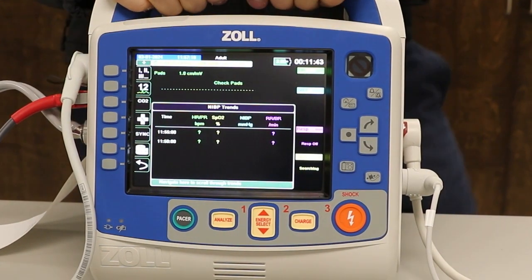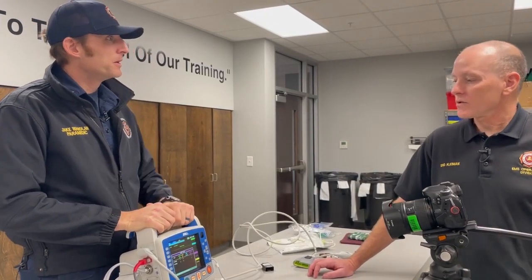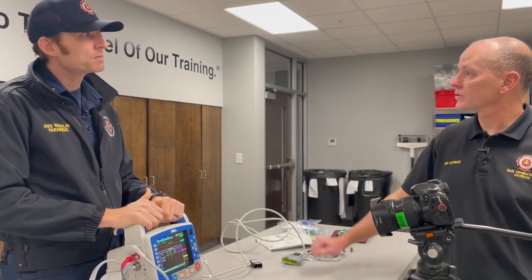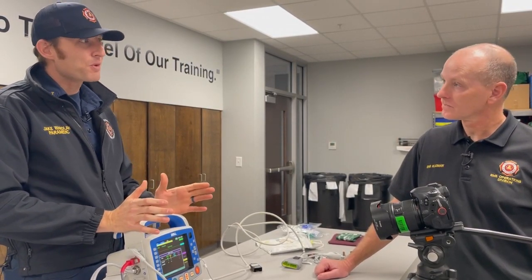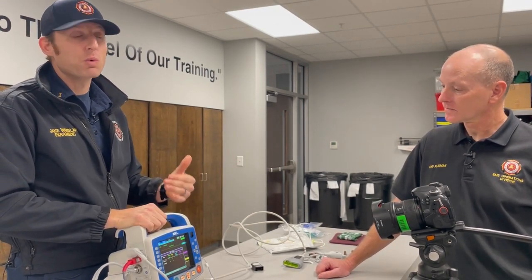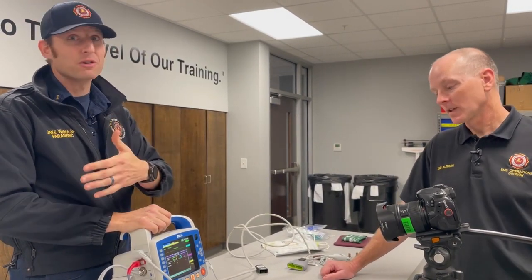This is a trend. So David, if you had to describe what a trend is and why that is important? The trend is looking at your vital signs over 3 to 5 minutes usually. Yep. So that can tell you if your patient's doing better or going worse. And I'll tell you, especially nowadays, since we're on scene for a long period of time, you probably need some trends. You need to reassess and assess patients. See where you're going, if they're getting better or getting worse. That trend screen is important, especially when you're going to transfer over. You kind of need to know where you're going so they understand what you did.